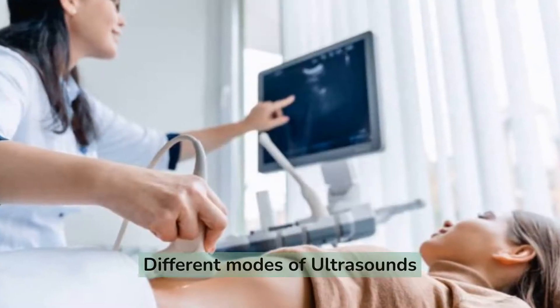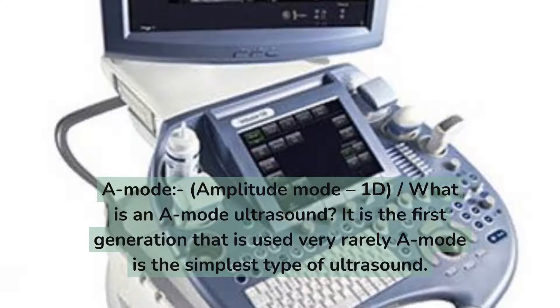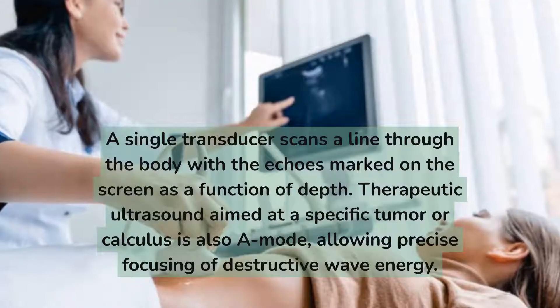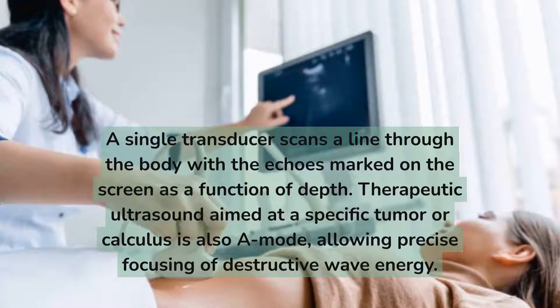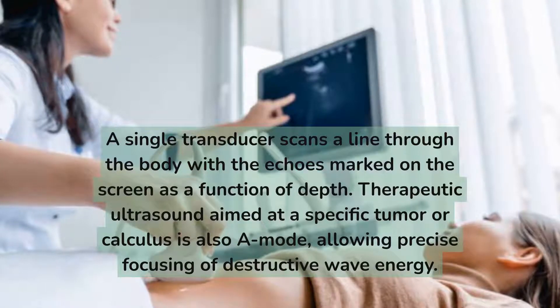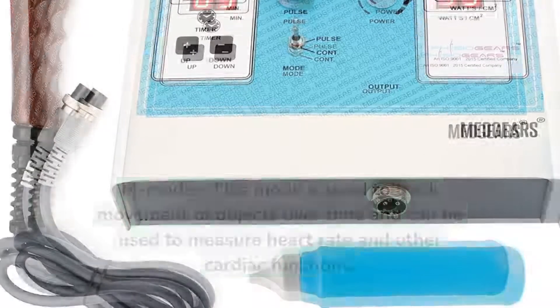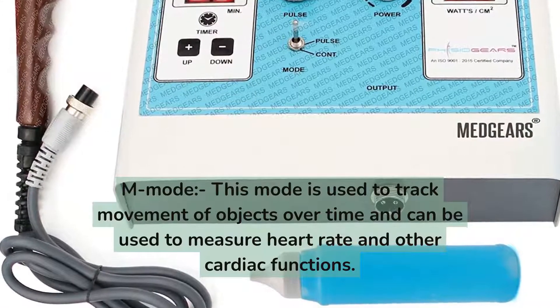Different modes of ultrasound. A-mode, or amplitude mode, is 1D and the first generation, used very rarely. It is the simplest type: a single transducer scans a line through the body with echoes marked on the screen as a function of depth. Therapeutic ultrasound aimed at a specific tumor or calculus is also A-mode, allowing precise focusing of destructive wave energy. B-mode is the most common mode, used to create a two-dimensional image of the target. M-mode is used to track movement of objects over time and can be used to measure heart rate and other cardiac functions.